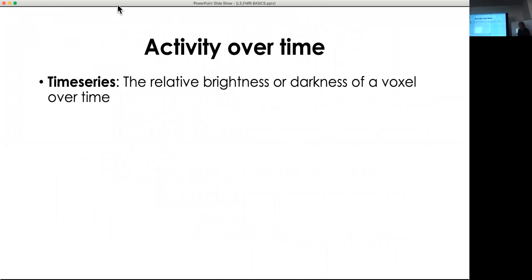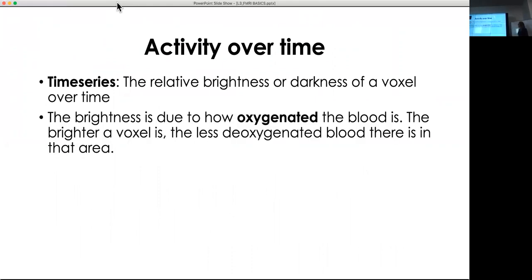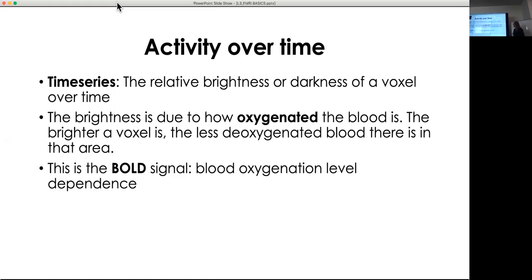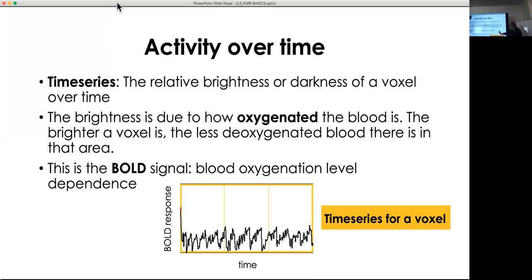Activity over time is referred to as a time series — the relative brightness or darkness of a voxel changing over time, which is the BOLD response. The brightness is related to how oxygenated the blood is. When you're doing a task, neurons recruit more oxygen into the active area. Less deoxygenated blood gives a brighter signal; more deoxygenated blood means spins go out of phase more quickly, producing a darker signal. BOLD stands for Blood Oxygenation Level Dependence — that's the signal we're measuring. Here's an example time series showing a voxel fluctuating up and down.